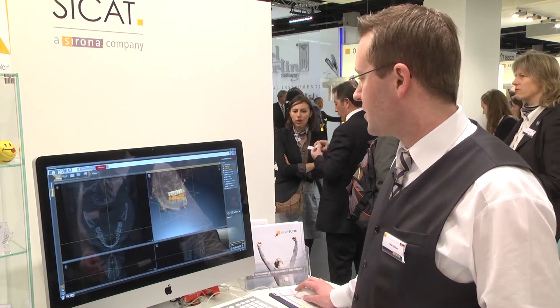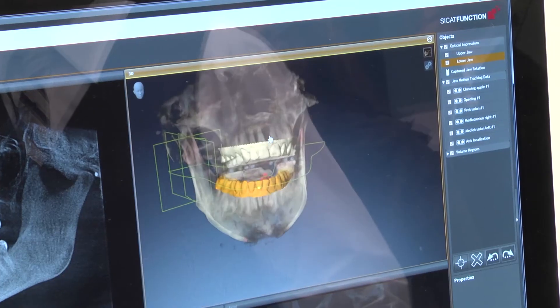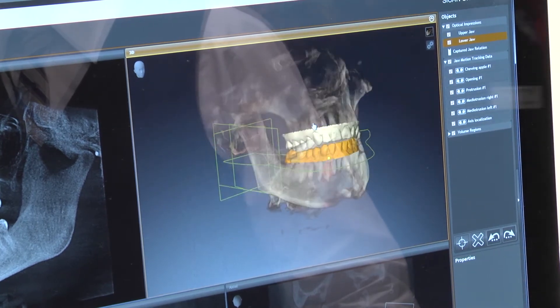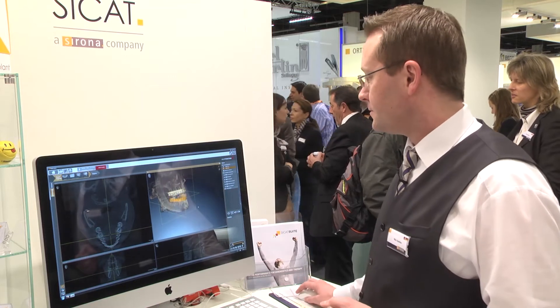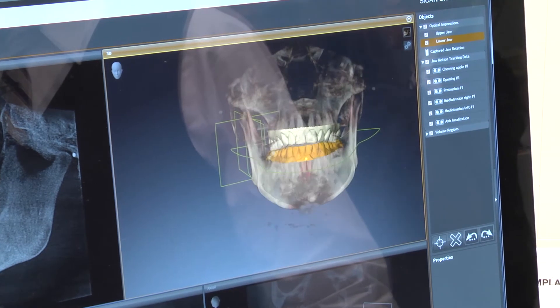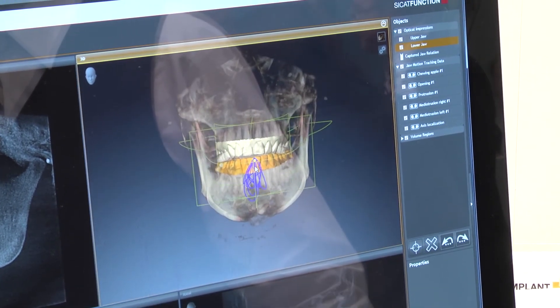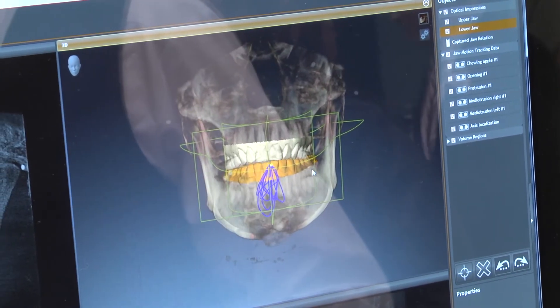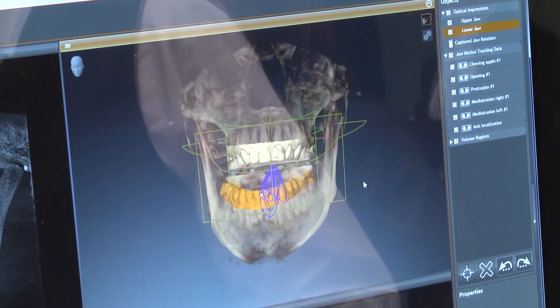I hit finish and directly go to the animation. Now we have the patient data not only in the CBCT data but also on the CEREC data that has been registered with the CBCT data. So what we can do now for the first time is really show the correlation — the spatial relation of the condyle and the fossa — within the actual patient anatomy. When I rotate this view, I am now able to place arbitrary reference points on the patient's anatomy to show how these reference points move in space and how the chewing patterns of the patient correlate with the actual patient anatomy.